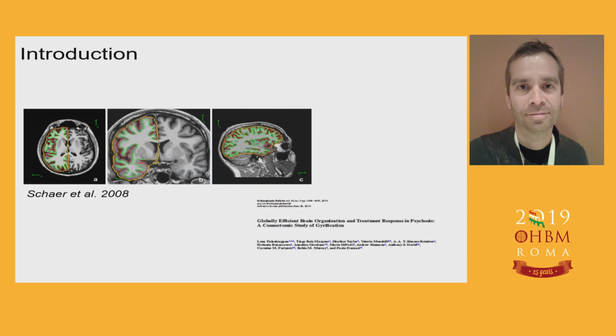So with this in mind, people started developing 3D measurements of cortical shape. And one of the most famous examples, as you may know, is the local gyrification index that was incorporated into the standard FreeSurfer pipeline. It gives you this local measurement of gyrified shape. And this has been used a lot in clinical designs. I'm putting just one example here on the bottom right.